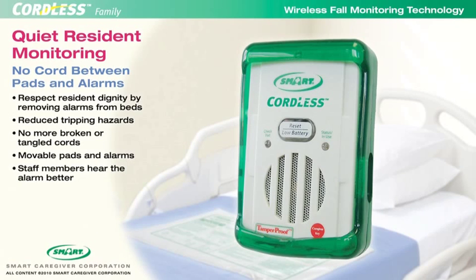Welcome to the instructional video on the Smart Caregiver Cordless System. The Smart Cordless System works with chair and bed sensor pads, floor mats, and nurse call buttons. The fall monitor alarms audibly and visually, notifying a caregiver when a resident or loved one is in need of assistance.